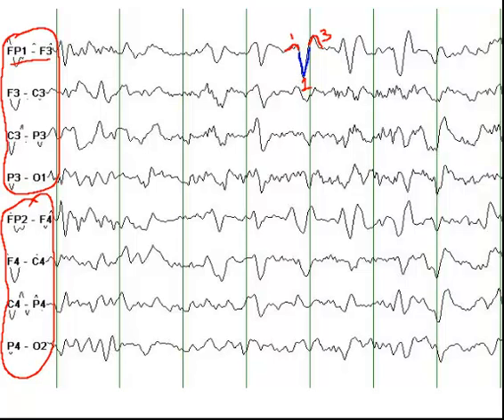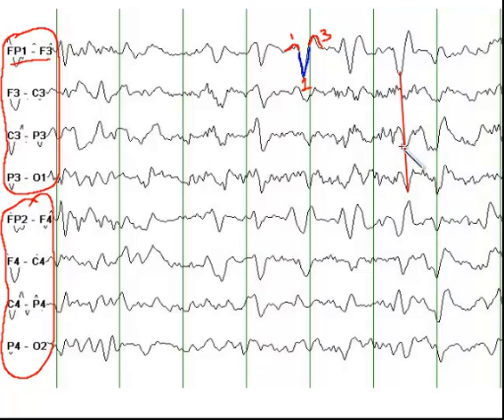I'll draw a line to show you that there is a lag that has been described between the frontal triphasic wave and the occipital, as it progresses from the frontal to the temporal. I'll use a red color — if I put my pointer at the apex here and draw it all the way to the occipital region, you can see that there is a lag between here and here. This lag has been described with triphasic waves, but has not typically been described with electrographic seizures.